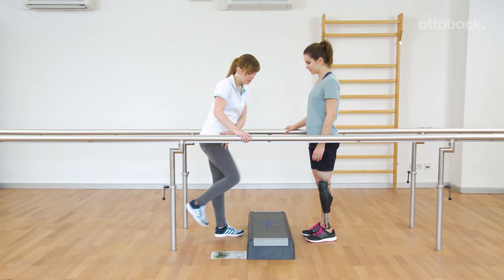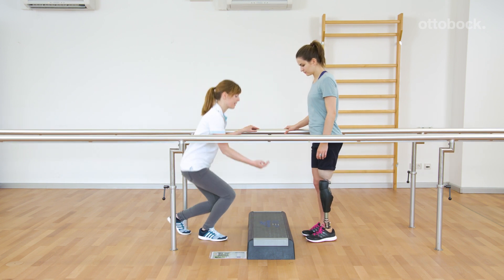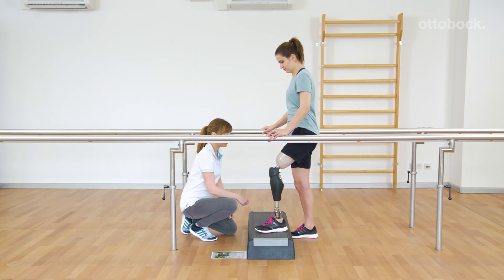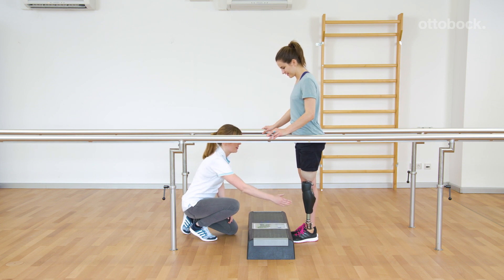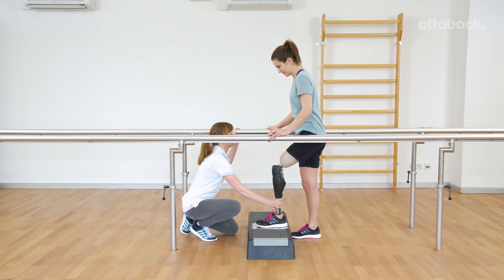In the second step, the focus is on foot placement. Foot, knee, and hip are aligned in the direction of movement. The foot has full contact to the step, making it easier for Rika to step up. A mark on the step board helps for correct positioning. Placing the full foot on the step provides a biomechanical advantage for stepping up.